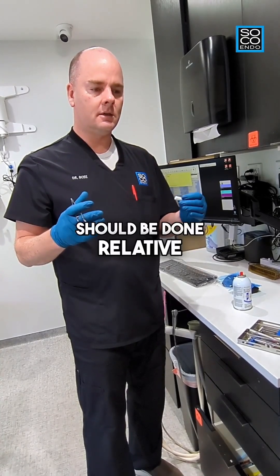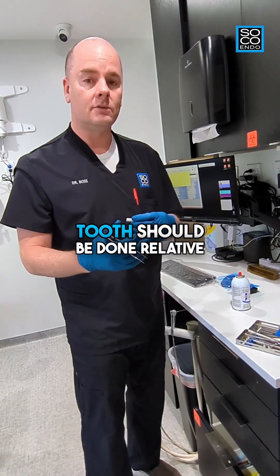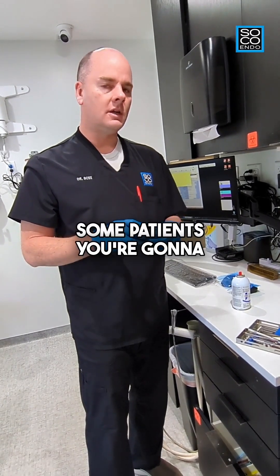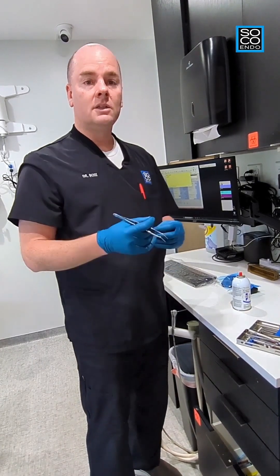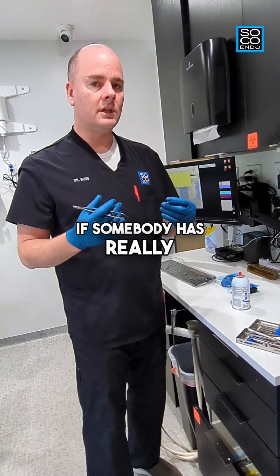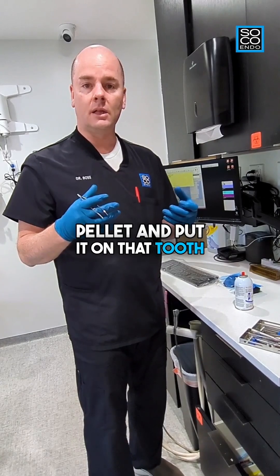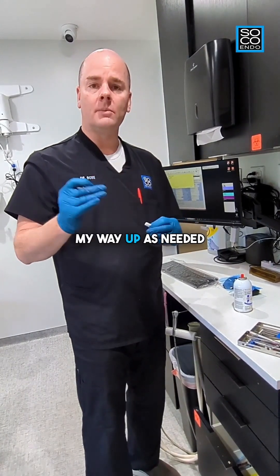Cold testing should be done relative — how much cold you apply to the tooth should be relative to what that particular patient's needs are. Some patients you're going to have to apply a ton of cold to get the teeth to respond; some, you'll need to apply very little. If somebody has really hypersensitive teeth in general, don't grab the coldest, biggest cotton pellet. I always start small and work my way up as needed.